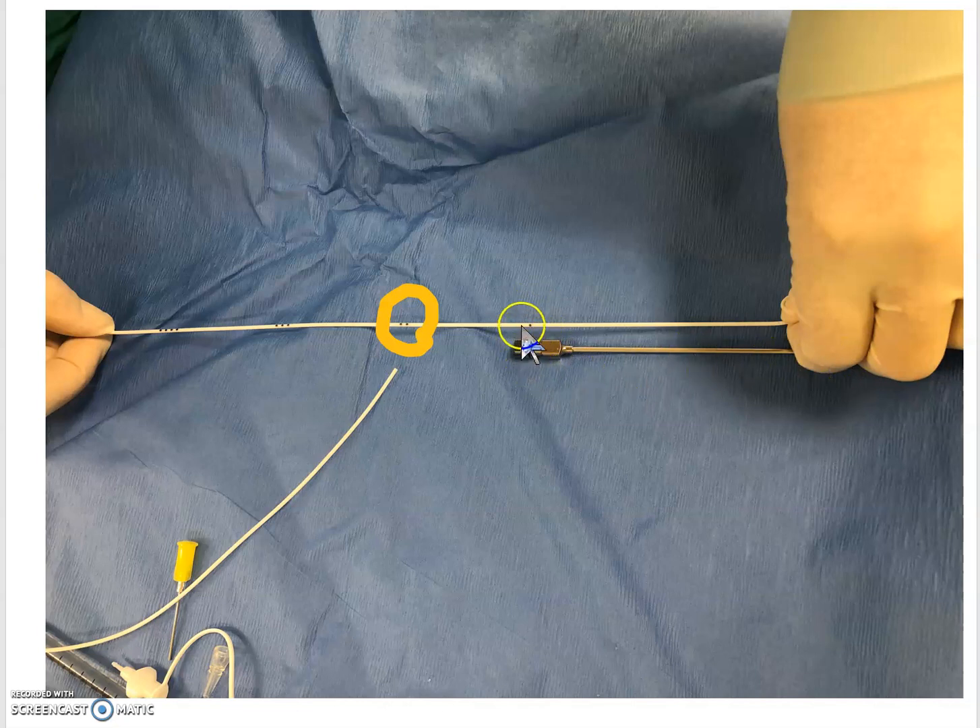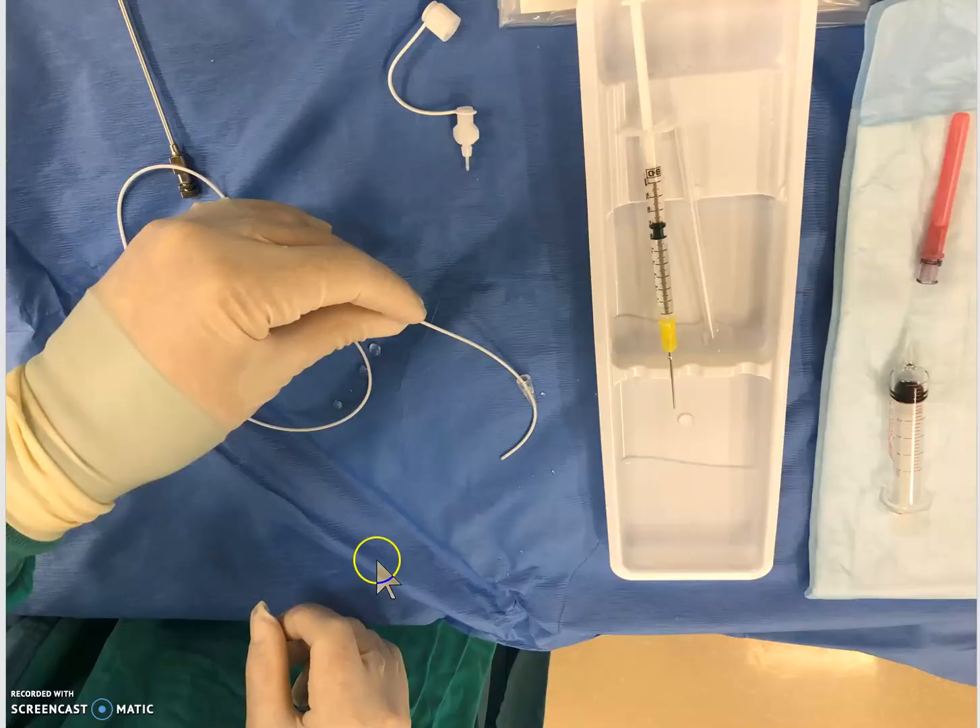This is not true for the spinal drain catheter. As you can see, the first marking is at the end of the spinal needle — so that is 10cm — and the second marking is at 15cm. Once your catheter is in the patient's skin, you're going to be somewhere between that first and second marking.